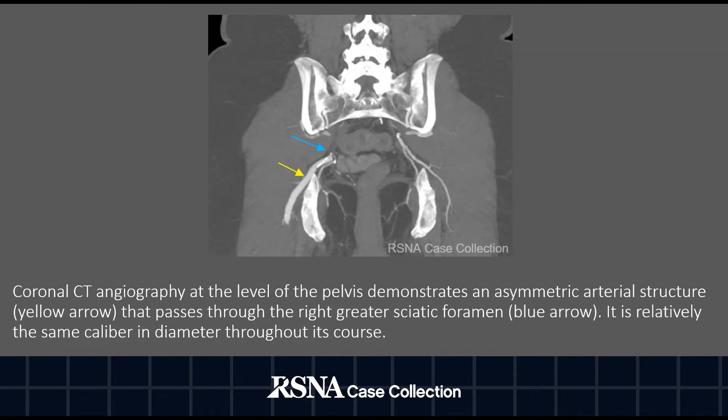Coronal CT angiography at the level of the pelvis demonstrates an asymmetric arterial structure labeled with the yellow arrow. It passes through the right greater sciatic foramen as demonstrated by the blue arrow, and is relatively the same caliber and diameter throughout its course.